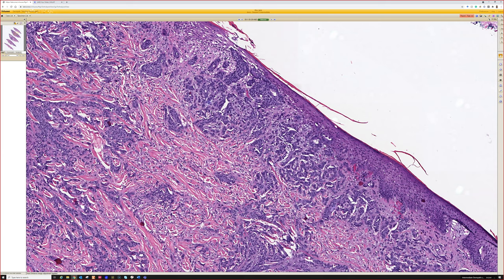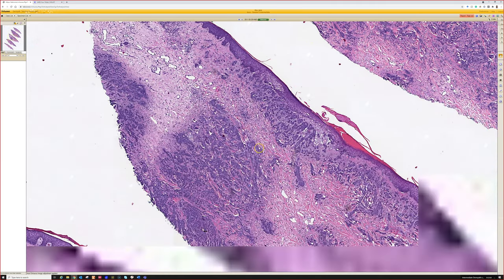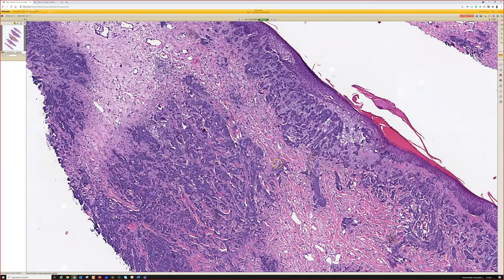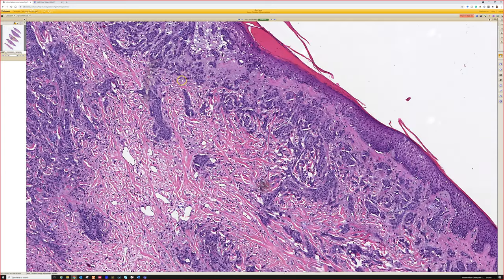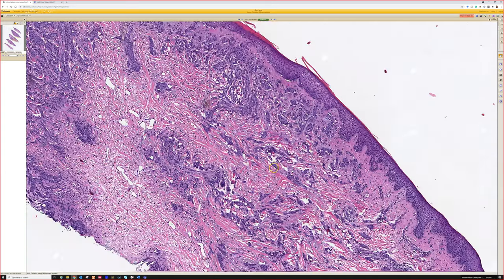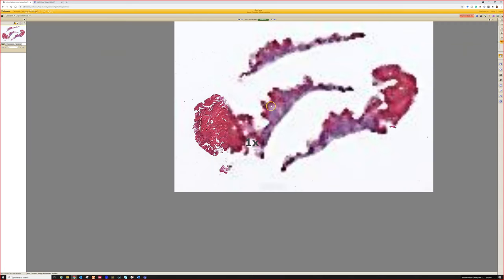Some breast cancers can stain for them. Occasionally lung adenos can have P63, and squamous cell carcinomas that are metastatic, doesn't matter where they're from, they all stain the same. So if you have a squam from the lung, met to the skin, it's going to stain just like a cutaneous squam. So that trick only works for adenocarcinoma metastatic versus primary skin. If it's strongly positive for P63 or P40, that is supportive of a skin primary. It's not perfect, but it's supportive. All right. So that's epidermotropic metastatic breast cancer. And of course, the history is the most important thing in these situations.